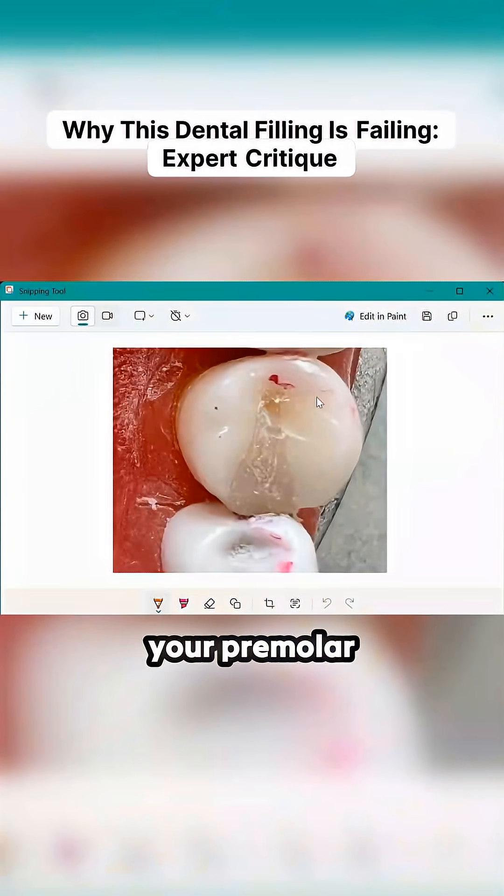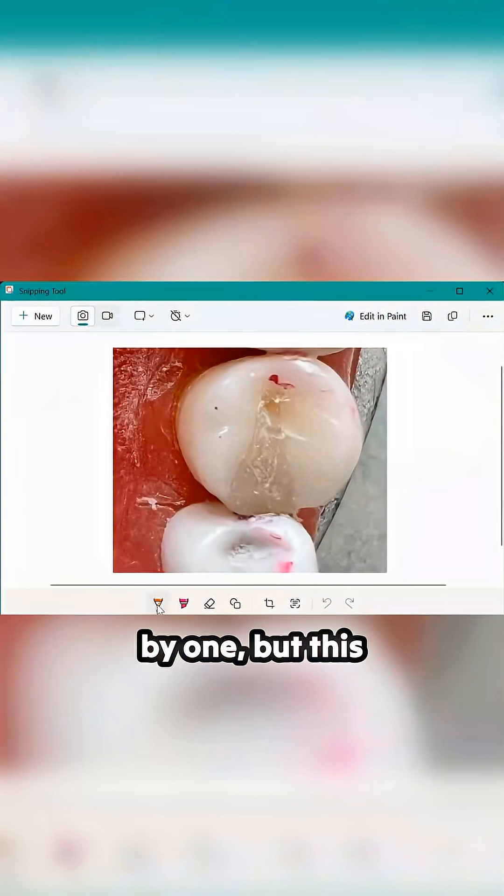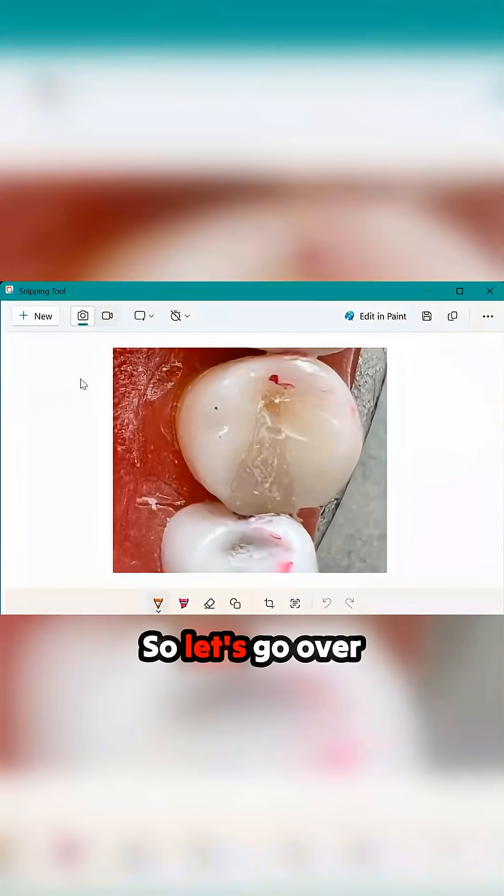Hey doc, I just want to go over your premolar fill. I'll go through each one one by one, but this is not good at all. So let's go over what needs to get fixed here.